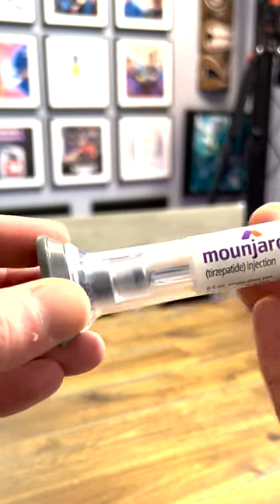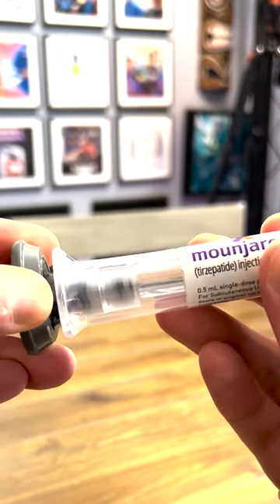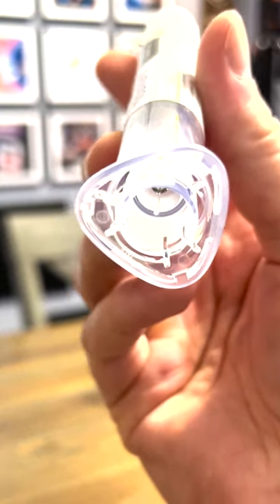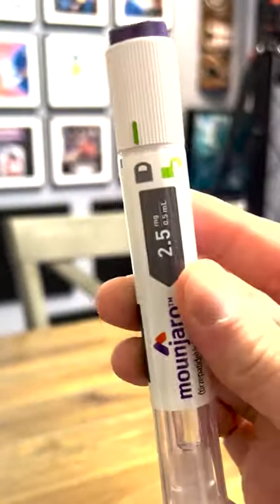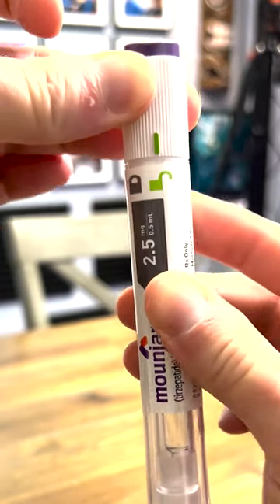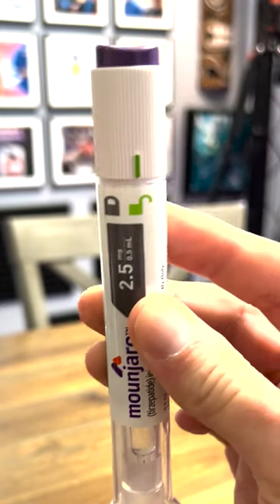First thing we want to do is take this little safety cap off — it pulls right off. The needle is already in there; you can actually see it at the end. Then you just want to take the locked icon and switch it over to unlocked, and it's ready to go.